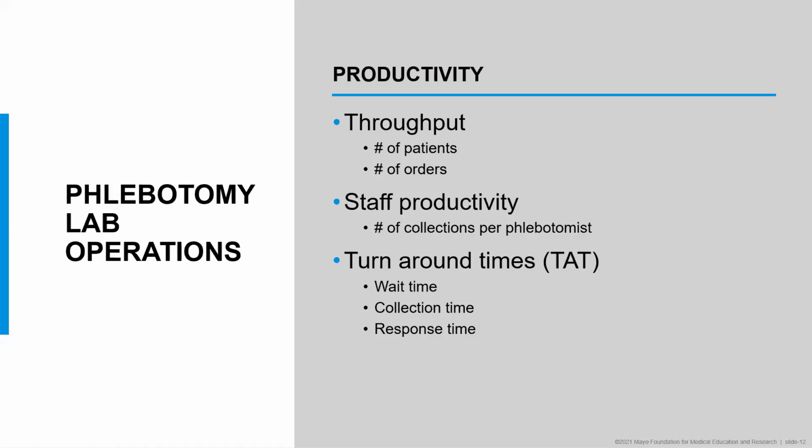Once the provider orders the test, we say we can provide the results at this time, but they count the phlebotomy time also. So we also have to look at how long things are waiting or taking in our area, which gets added to the testing lab. When we talk about turnaround time, it's not only the testing lab, but also we have a component of that, because we do the collection. So we have to make sure that we understand that and do our collections on time.